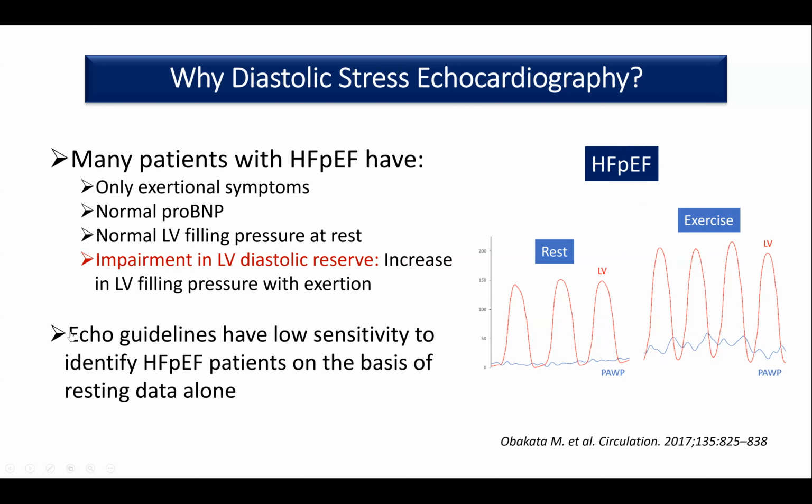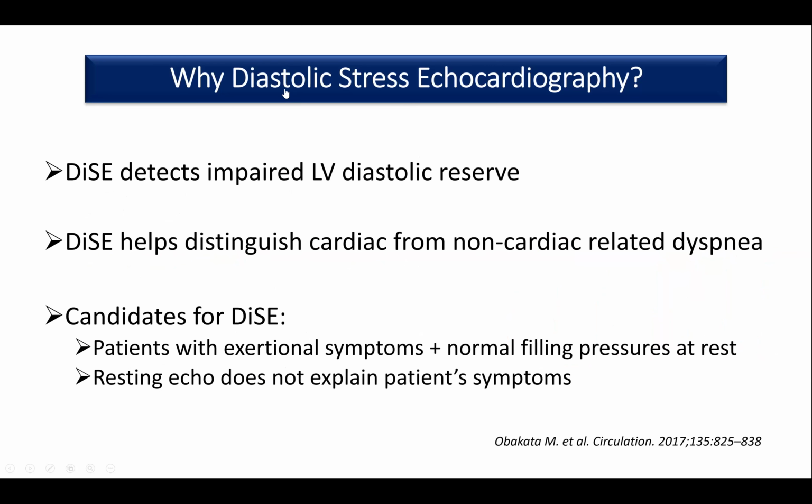Okay. And remember, the echo guidelines have low sensitivity to detect patients with HFpEF on the basis of the resting data alone. I told you we miss quite a bit of these patients. So this is when we should do a diastolic stress echo, because the diastolic stress echo detects the impaired LV diastolic reserve. And it helps us distinguish cardiac from non-cardiac related dyspnea.